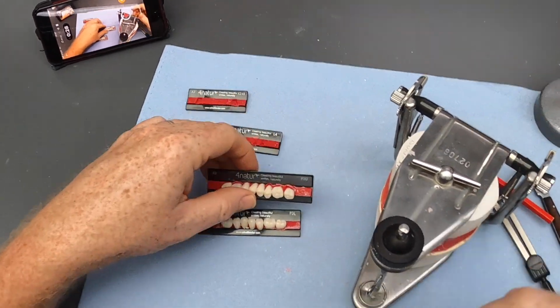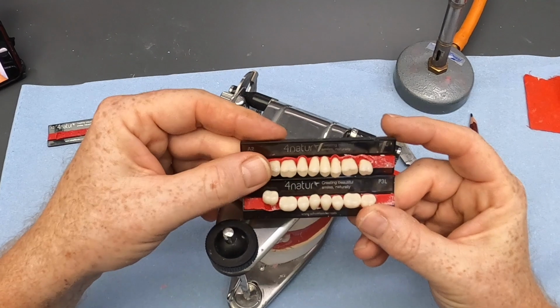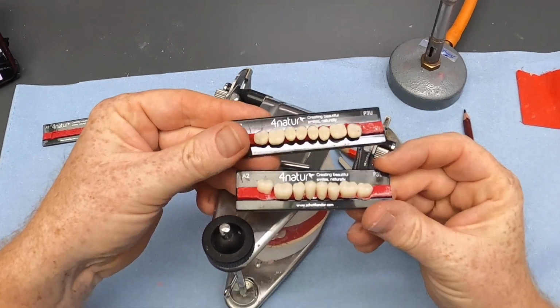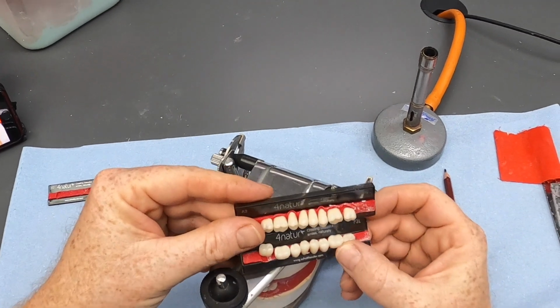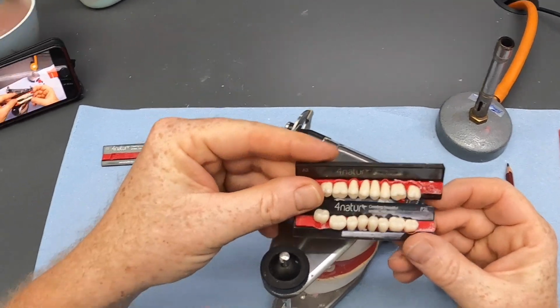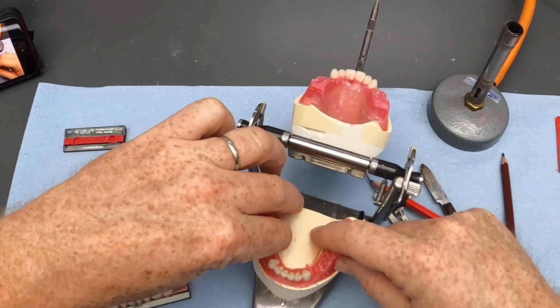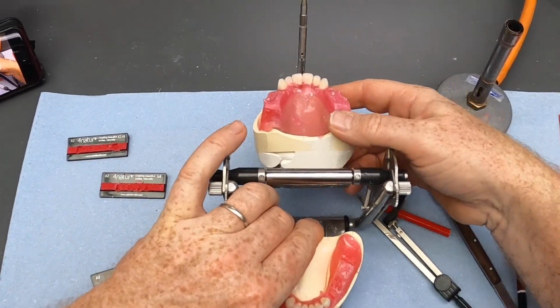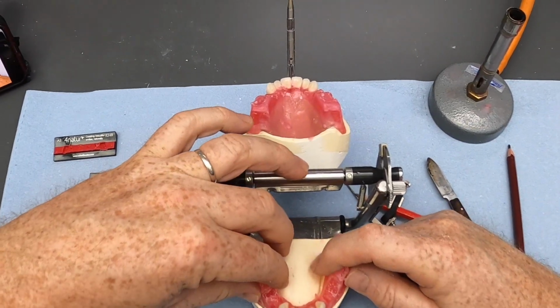I've got our upper and lower teeth here. We're going to try these. They're a bit higgledy-piggledy on the card because I've taken them off and ground the underneath in preparation for processing. So I've ground the underneath of each one and placed it back on the card to save time on the video. So where do we want to position this key lower tooth then, the molar tooth?